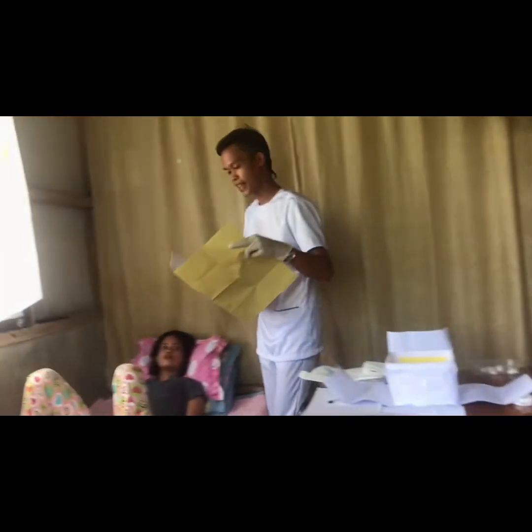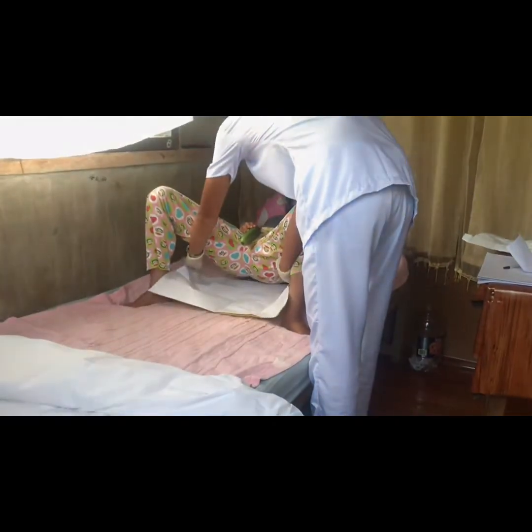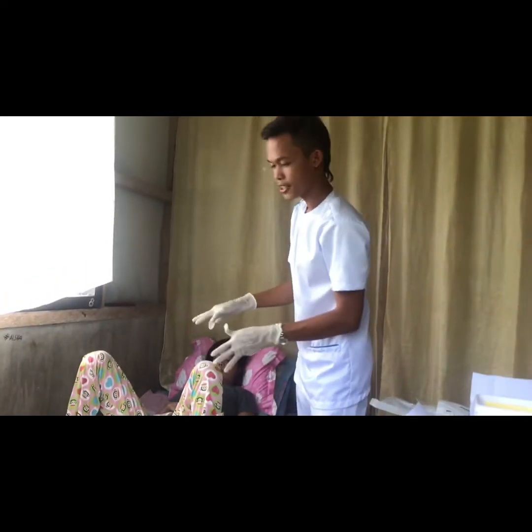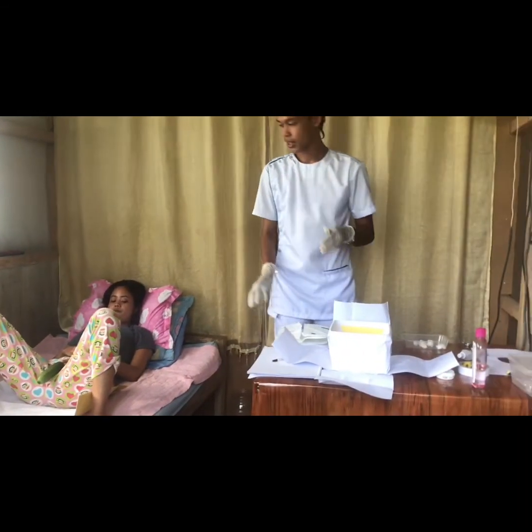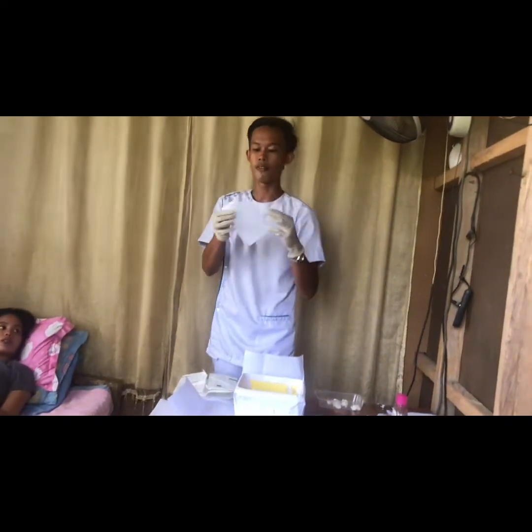So sir, please help me. Please raise your waist. I'm going to insert this one. Okay, thank you. So the drape, as you can see, is now inserted. So for this time, I'm going to dispose of it properly. And then after that, we're going to place the fenestrated drape.